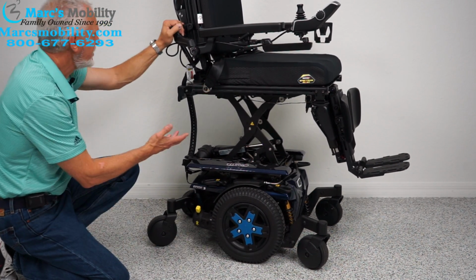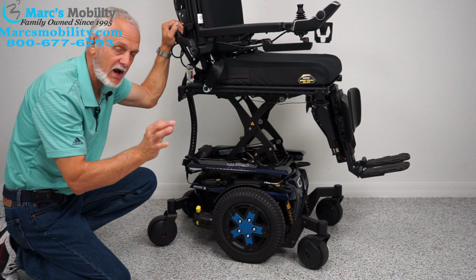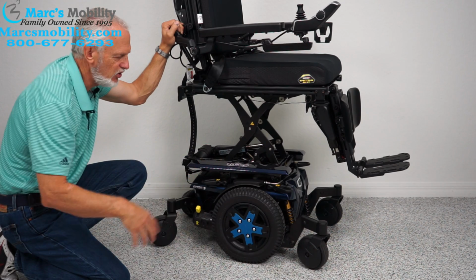So right now, this chair, the way it's set up with all these functions, weighs about 425 pounds. That's correct, 425 pounds. This is a heavy, heavy chair. So if you want to lift it or push it, you couldn't do it.